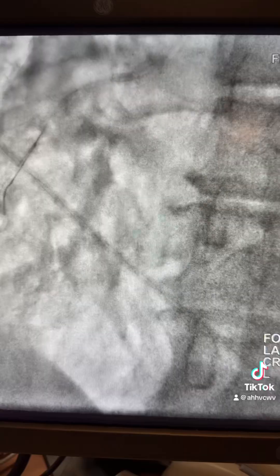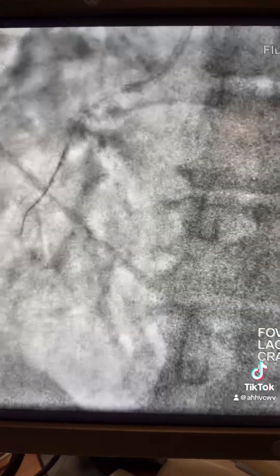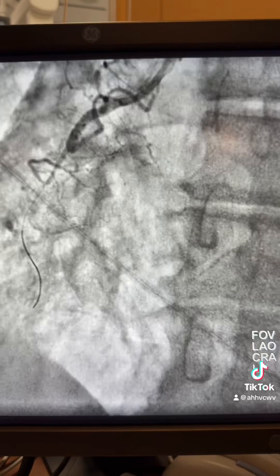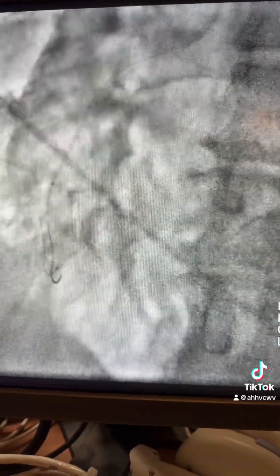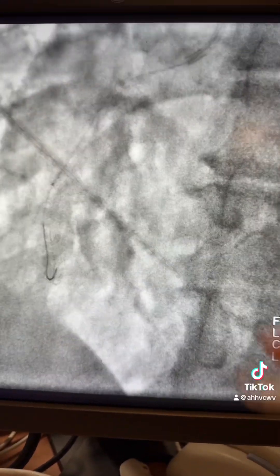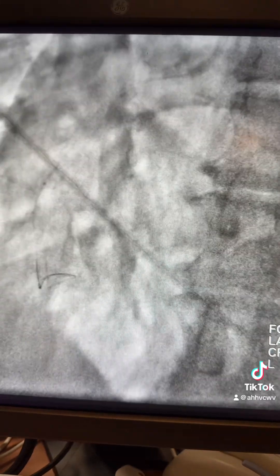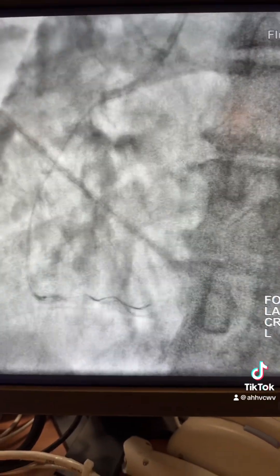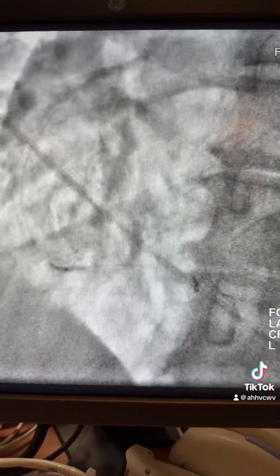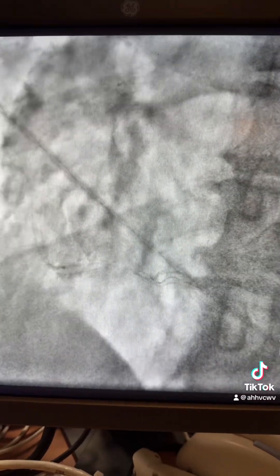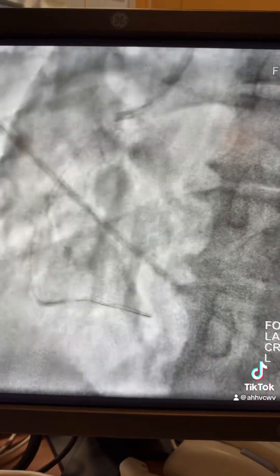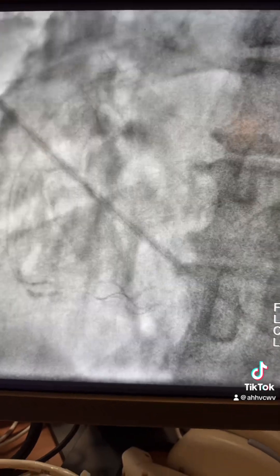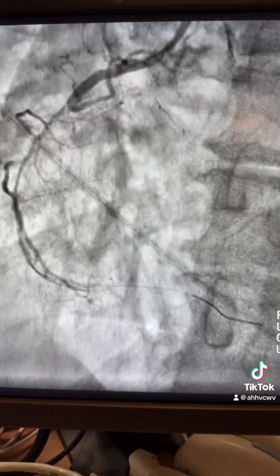We reach this bend — for this bend I have to inflate the balloon here, and while the balloon is inflated, try to advance the wire distally. Similarly, I have to advance the balloon inflated distally, and while the balloon is inflated at nominal pressure, you can spin the wire distally. Of course, you need to make sure there is no resistance upon advancing the balloon.